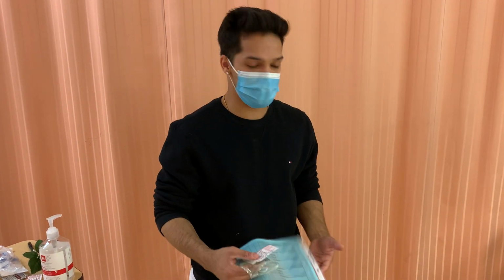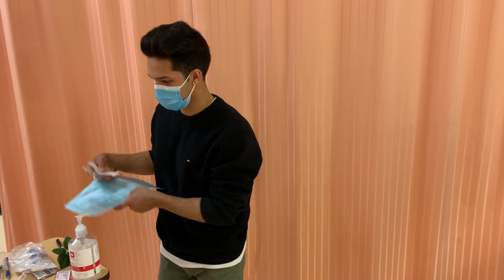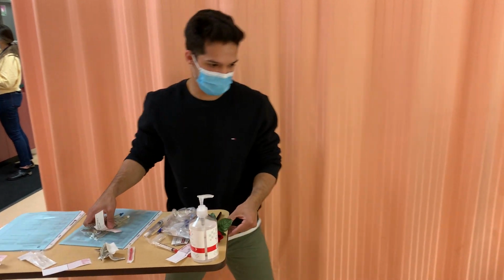Nobody has given a signed offer, so I will be giving it, and I will be signing off for it with my second nurse. Once I've done my third check, I'm also going to be doing some patient education.